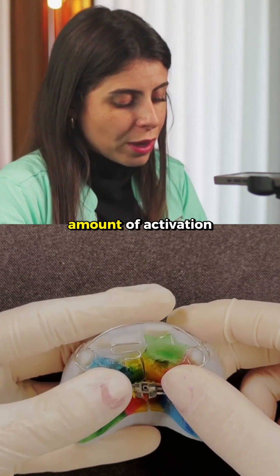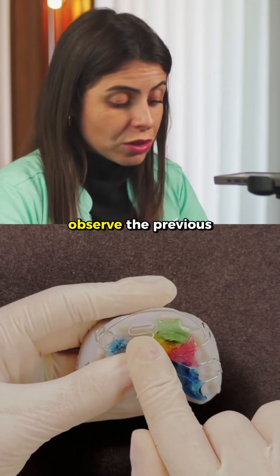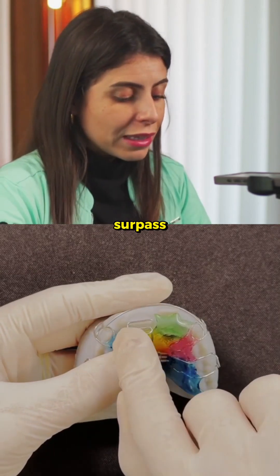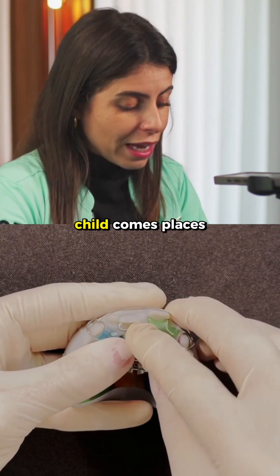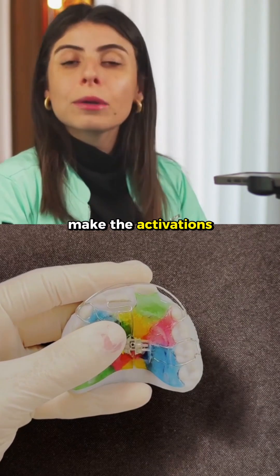How can we know about the amount of activation? We will always observe the previous extension of this S-Spring, knowing that it should gently surpass the most anterior portion of the central incisor. This way, the child comes, places the spring back, and during the month begins to make the activations.